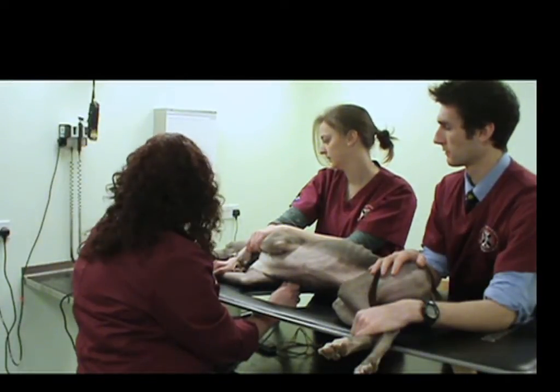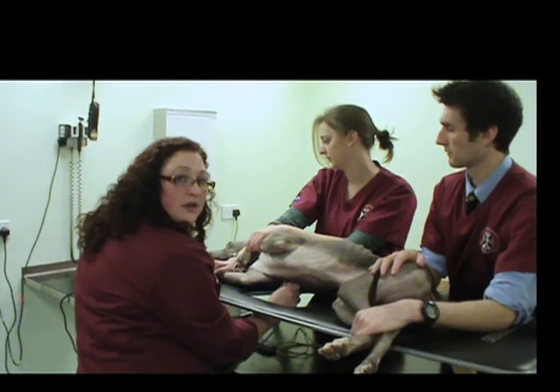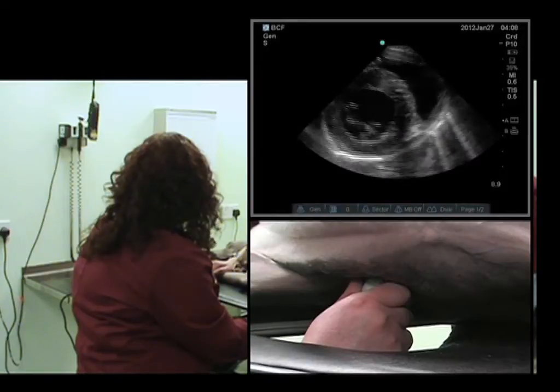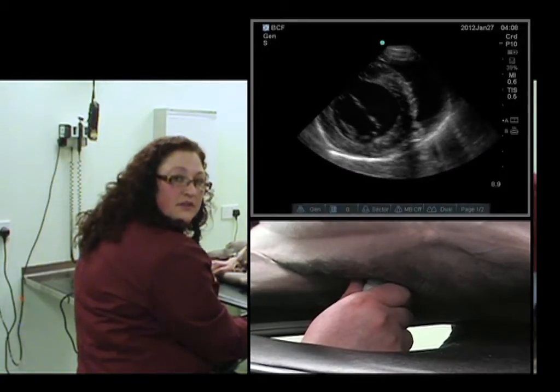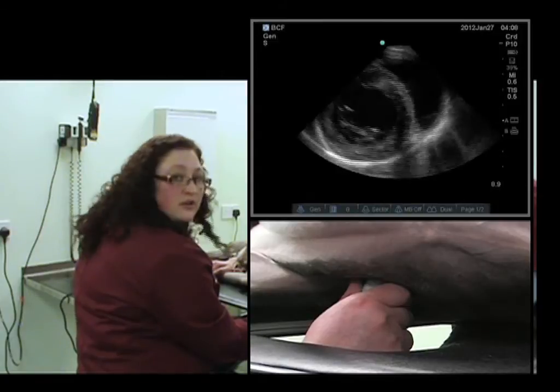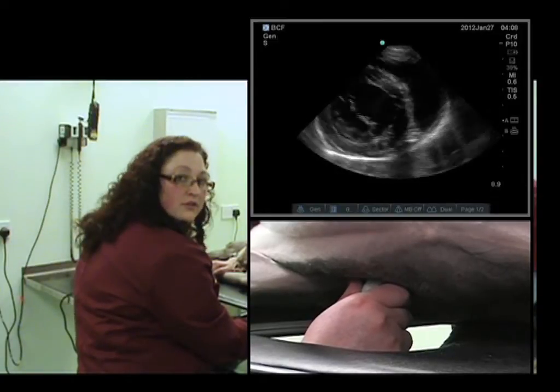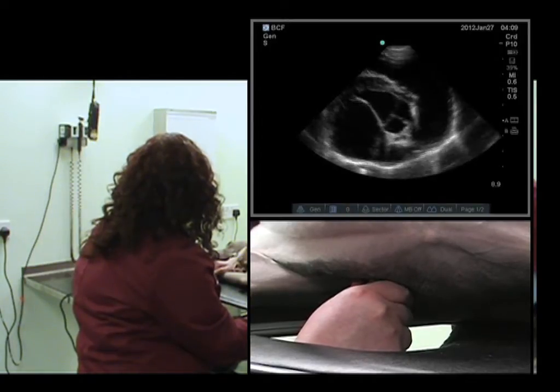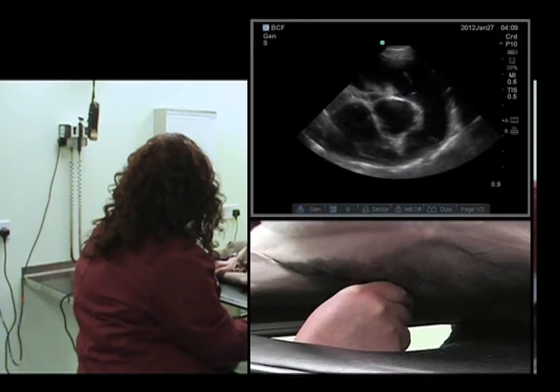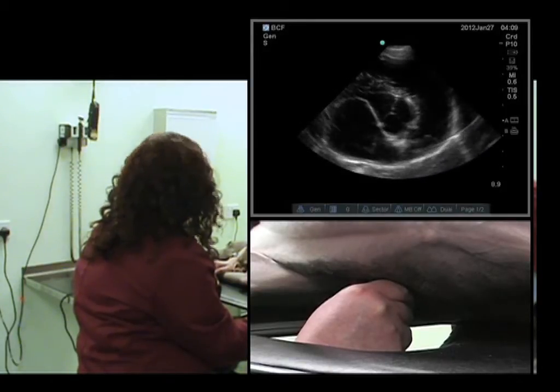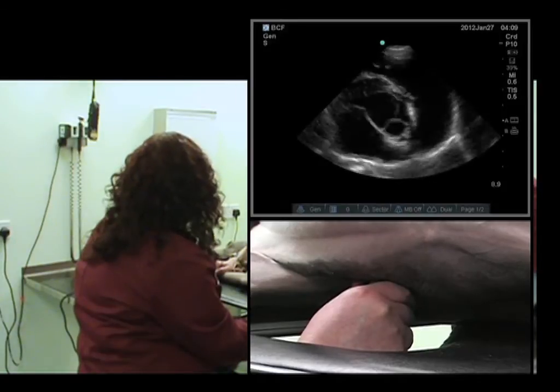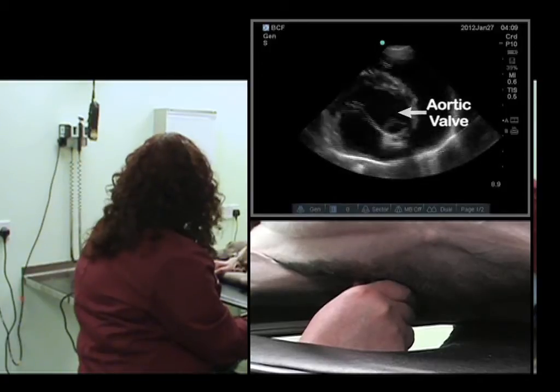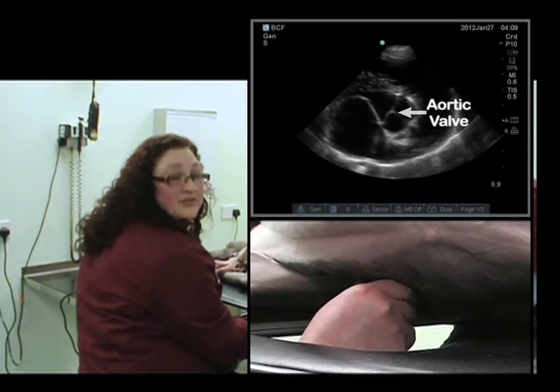The next view that we can obtain is that which incorporates the left atrium and the aortic valve. To obtain this, we stay in the same rotation and continue to fan cranially, as we did to obtain the fish mouth. What we will begin to see is the aorta coming into view with the three cusps of the aortic valve, sometimes referred to as the Mercedes-Benz sign.